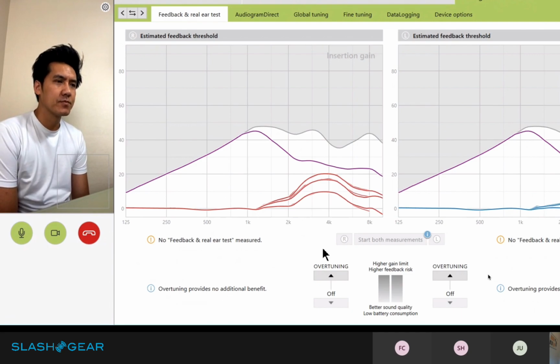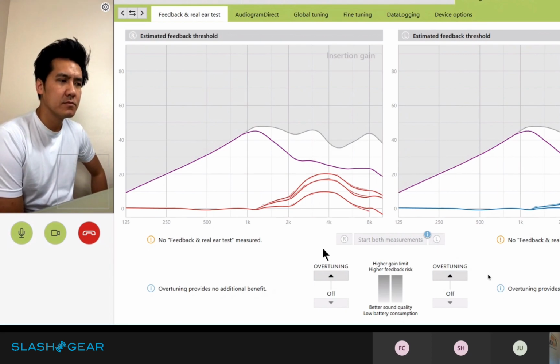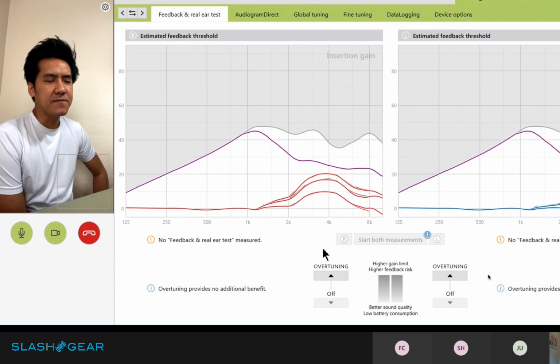There's also a case where we have clients who just love a more open fit. And maybe it's not appropriate based on their hearing loss, but then we can see what the compromise is with managing the feedback, and making sure they're getting the amplification they need, and working with the earpiece that they're most comfortable with. I think the feedback isn't bad.